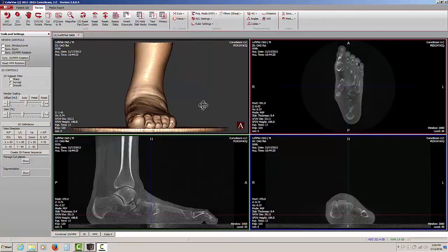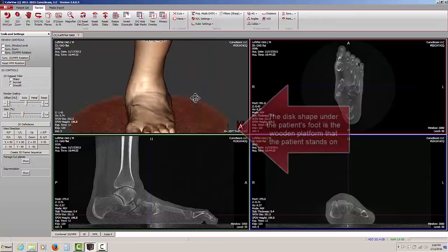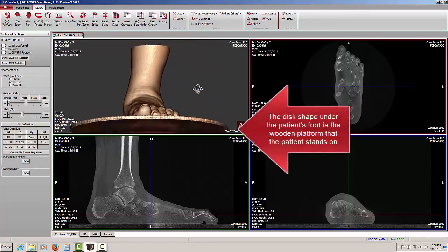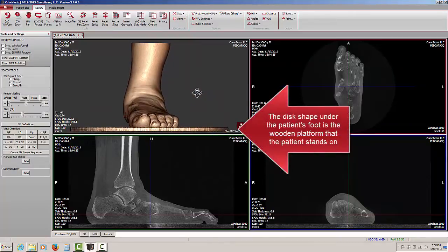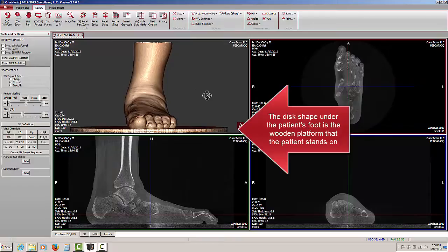You may also notice in the 3D rendering that there is what appears to be a disk shape under the patient's foot. This is the wooden platform that the patient stands on.